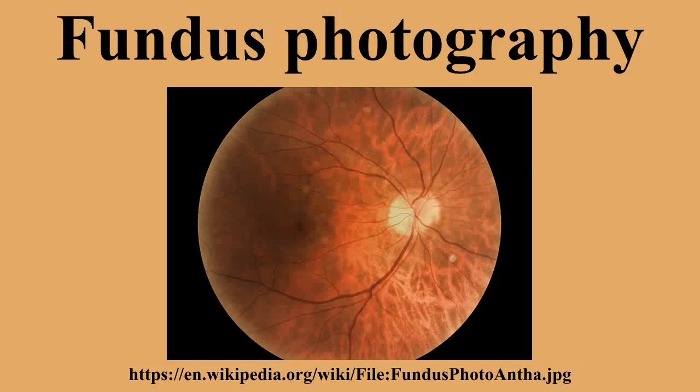There has been some controversy regarding the first ever successful human fundus photo. Most accounts state William Thomas Jackman and J.D. Webster, since they published the technique along with a reproduction of a fundus image in two photography periodicals in 1886.